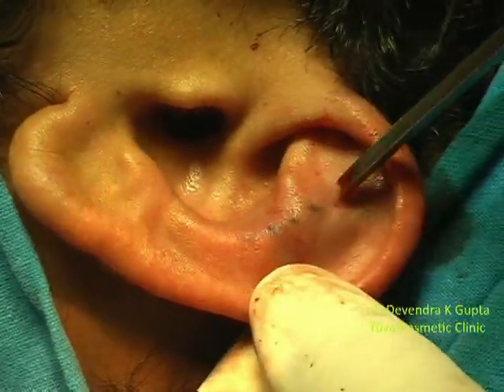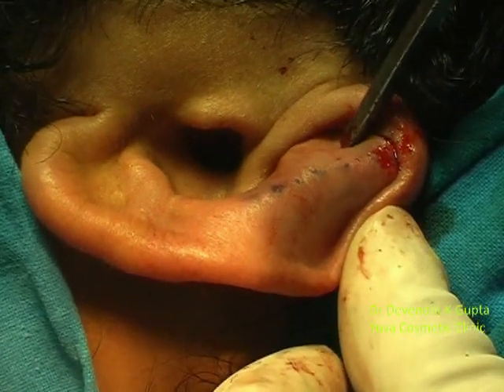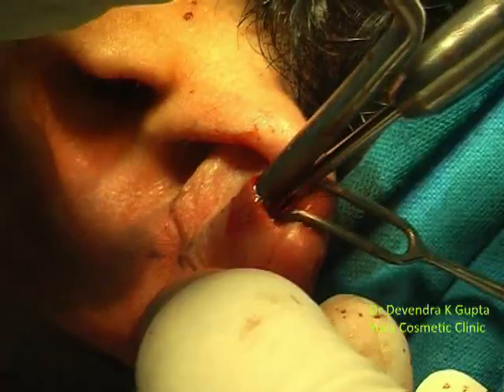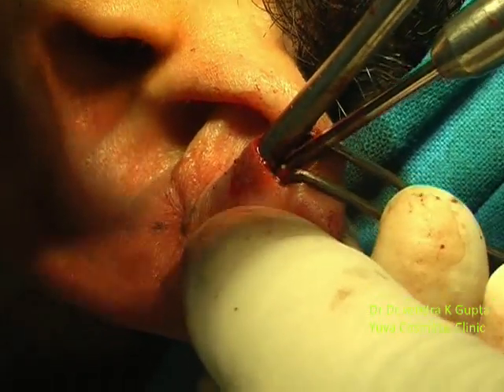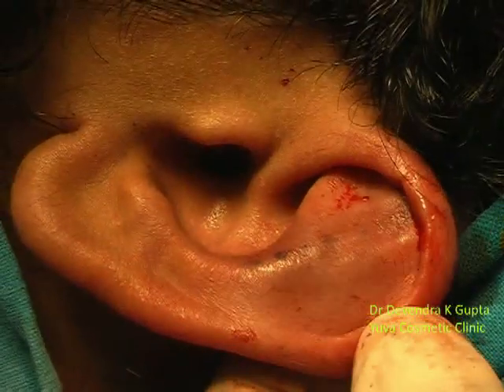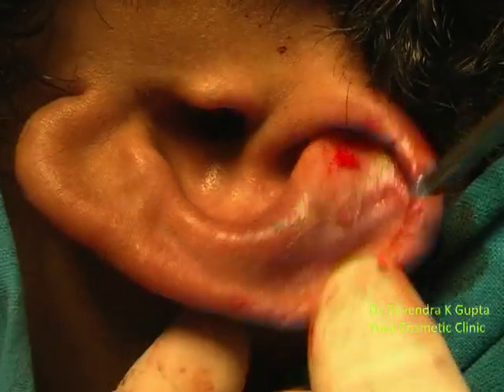Notice the abraded area here — this is the groove. You can notice the abraded area at the anti-helical border, and this will be approximated. The groove is about one and a half to two millimeters in size so that the knot can be buried. This area I have scored out, and now it will bend, and I will put a stitch here. You can see this part is a V shape.